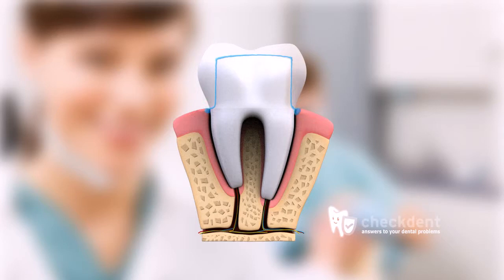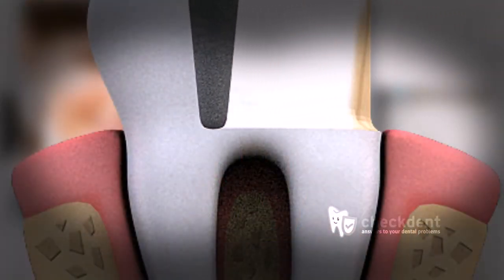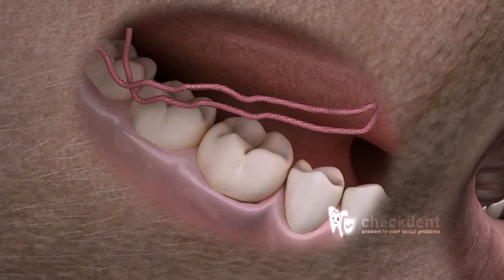The adhesive can flow easily during cementation. This allows for a thin joint. The technician has enough room for the ceramic and the edges are tightly closed, preventing food lodgement. To achieve a round margin, cutting must be performed under magnification. Furthermore, particular criteria must be observed while taking the impression.